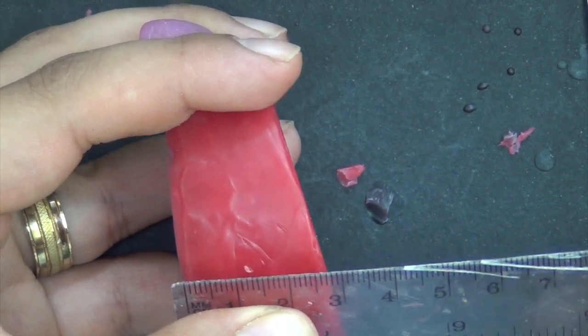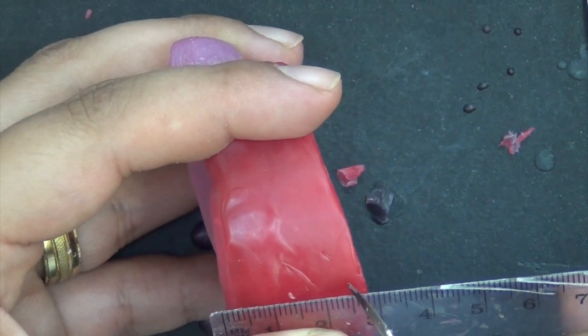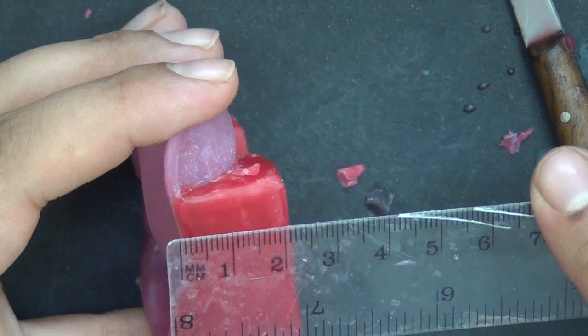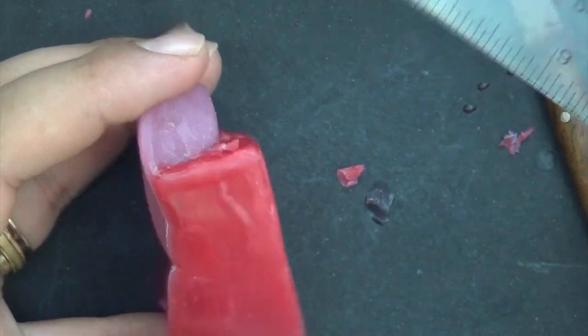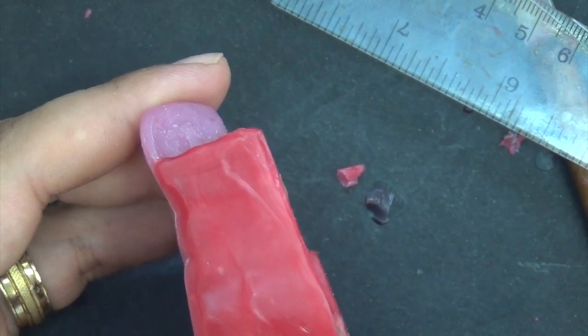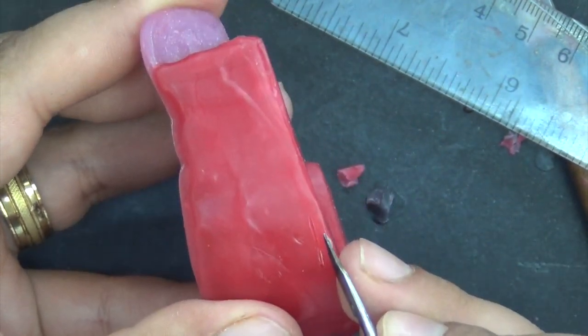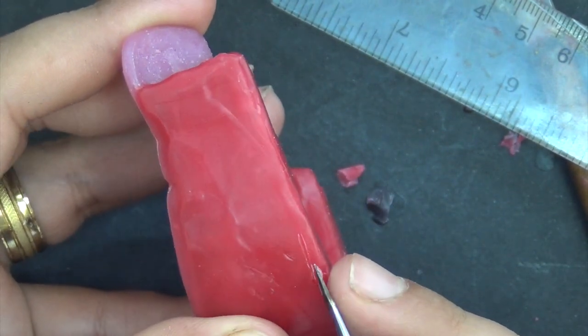So here it also measures 27 millimeters. We're going to mark 22 millimeters. And posteriorly it measures 20 millimeters, which is the desired height. And then draw a line that connects all the four dots together.